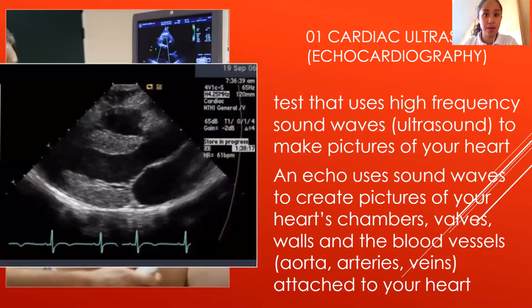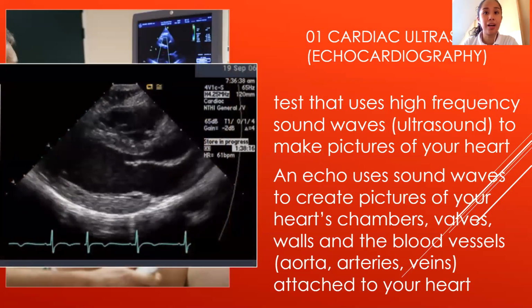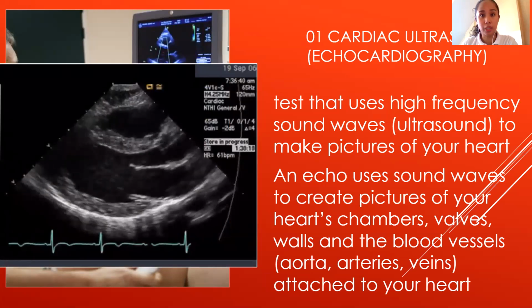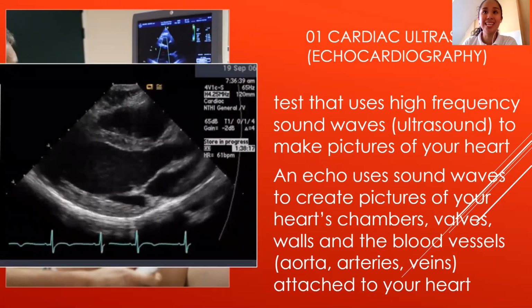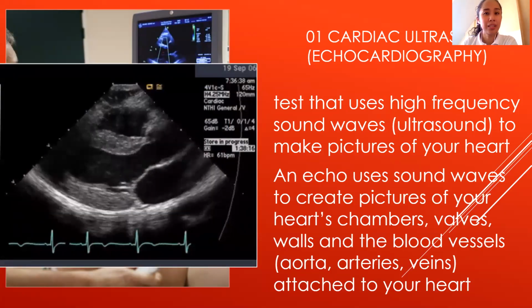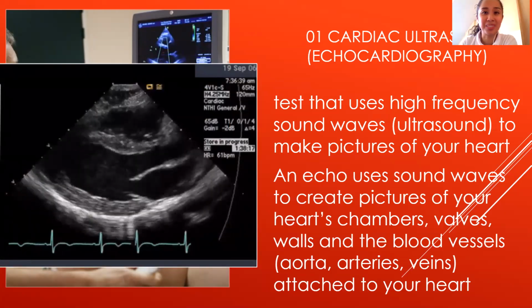Ultrasound is not only used to visualize the embryo of pregnant women, but also the heart. That is called cardiac ultrasound, or echocardiography.